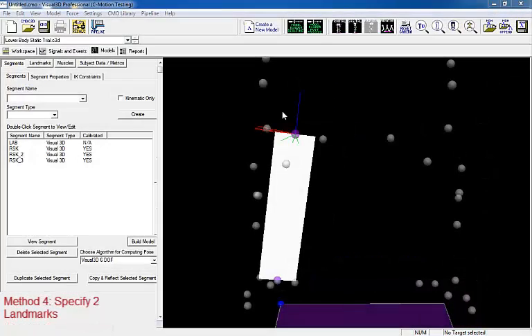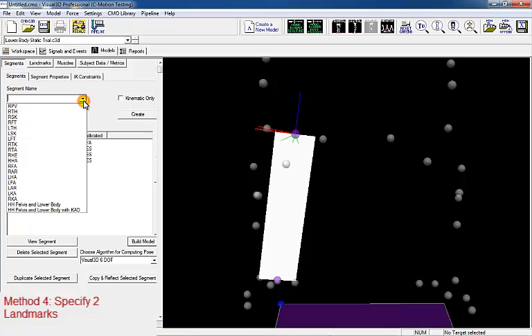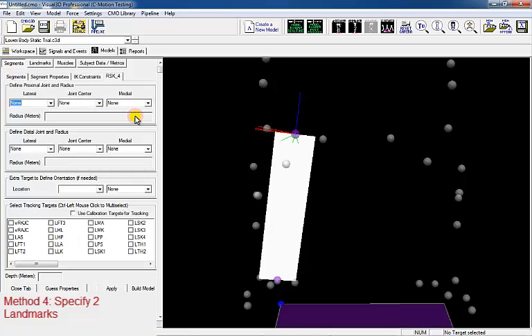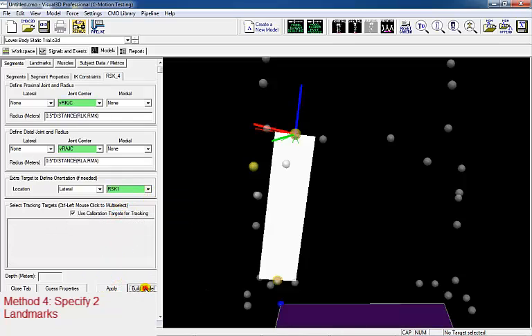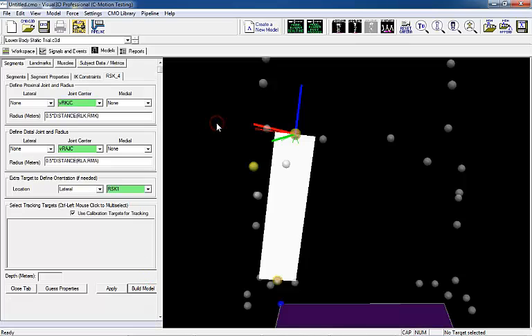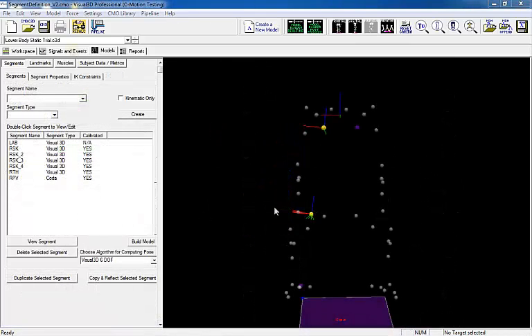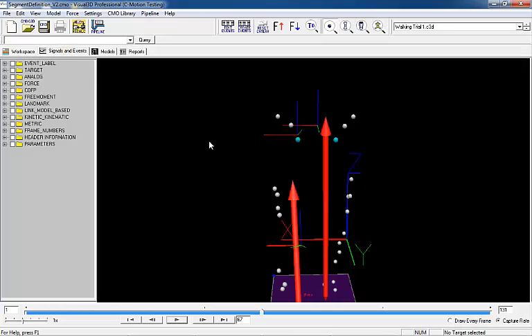Now we are going to define a model using two targets to define the proximal and distal ends, with one marker to define the orientation of the segment. We will use our virtual knee and ankle joint centers to define the proximal and distal joint locations. We can use our equations to define the radius. To define the orientation of the segment, we are going to use RSK1 to define the lateral location. The plane is drawn between the proximal and distal ends of the segment as well as the specified lateral target. I created hip and thigh segments so we could look at the effect these different segment coordinate systems have on the knee angle.